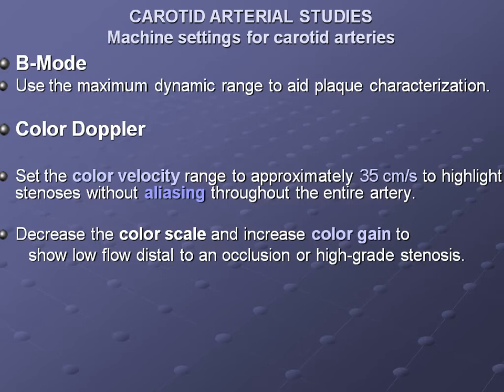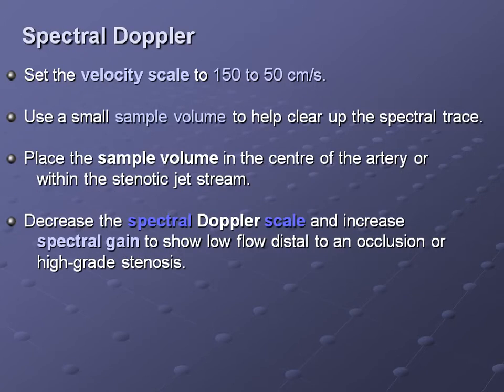Yani, you should increase the scale, increase the PRF, okay? Decrease the color scale and increase the color gain to show low flow signal, low flow distal to an occlusion or high grade stenosis. We will talk about it and we'll show it in details.